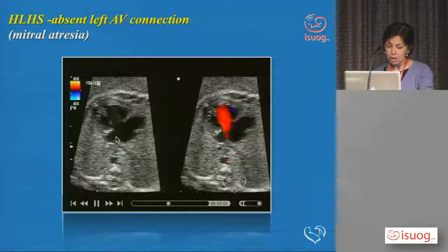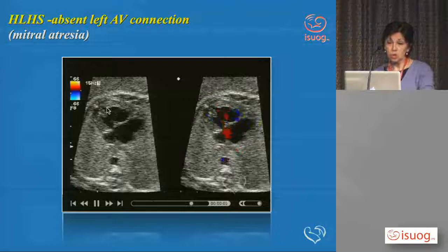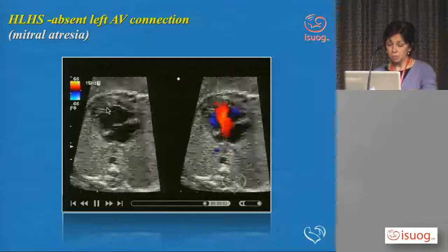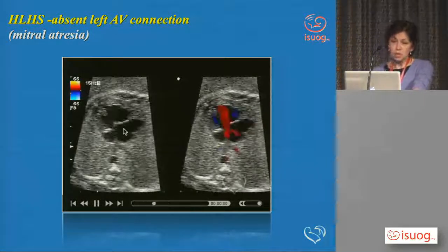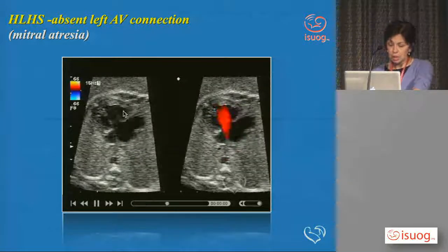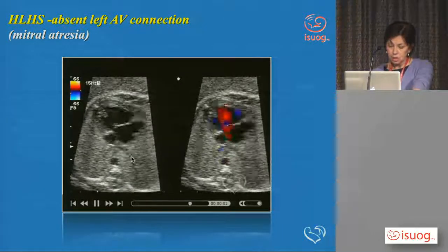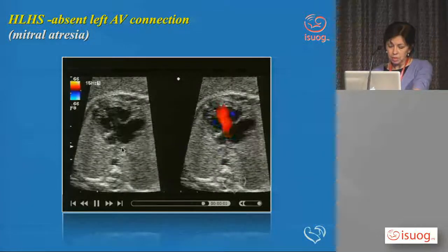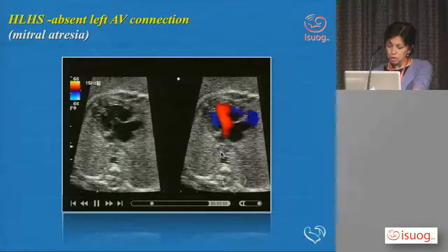And actually this case was initially seen elsewhere and was giving a good prognosis, as good a prognosis as you can give for hypoplastic left heart, with a mortality of about 20%. This case turned out to be a very dilated coronary sinus, and you just see the pulmonary veins coming here perhaps. There's a little bit of flash there, a little bit of flash here, can you see?